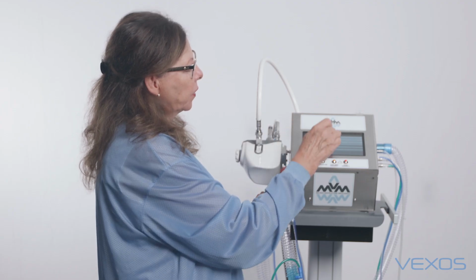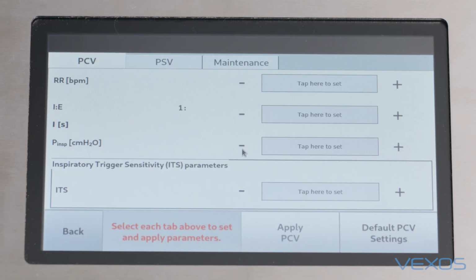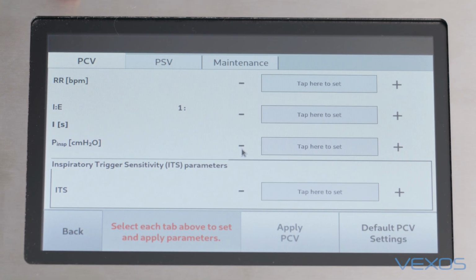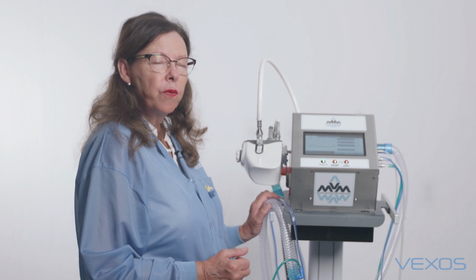The next test that we'll do is the settings. In this machine, there are two modes. One mode is called PCV, and it stands for Pressure Control Ventilation. The other mode is called PSV, Pressure Support Ventilation. For further information concerning these modes, please look at the user manual.